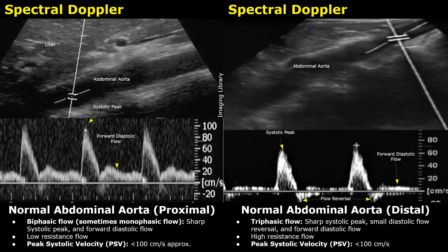The biphasic flow has two components: a sharp systolic peak, which is the first component, and the second component is the forward diastolic flow. Because of these two components, it is called a biphasic flow. This biphasic flow is seen when there is low resistance to blood flow. The proximal aorta has a low resistance flow.